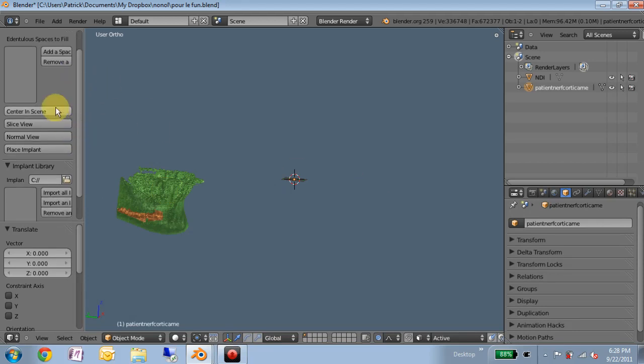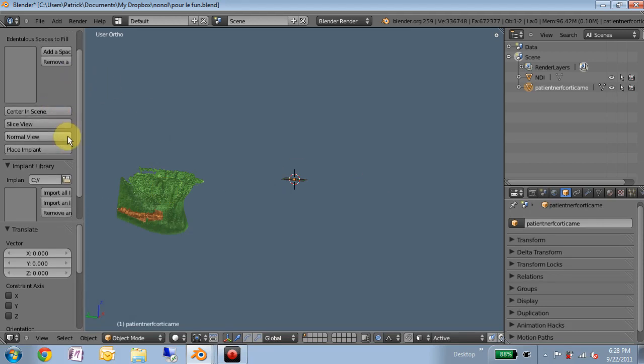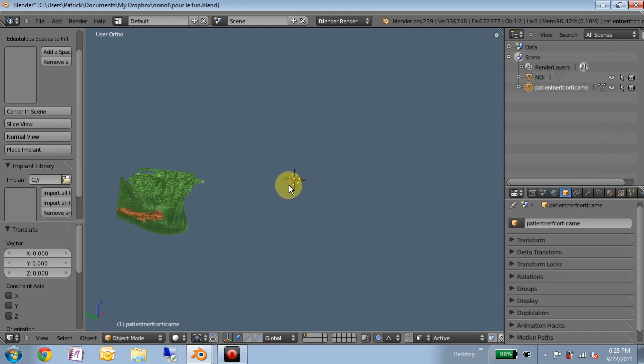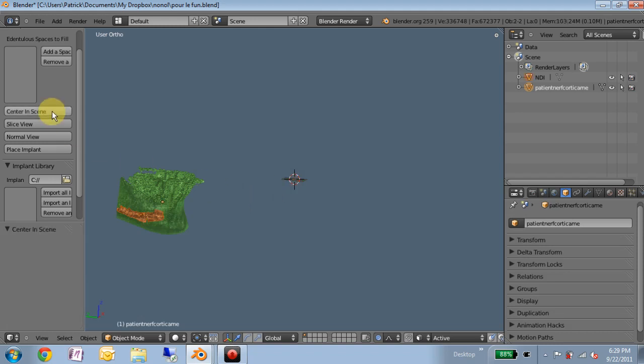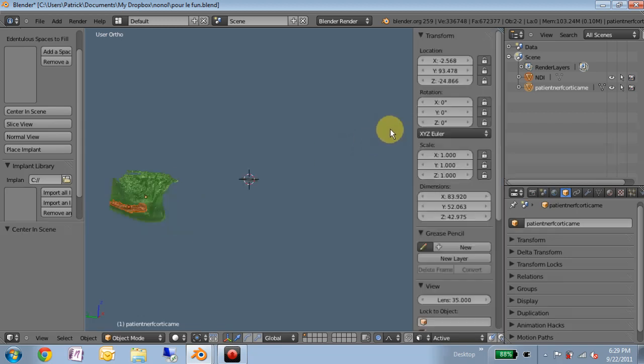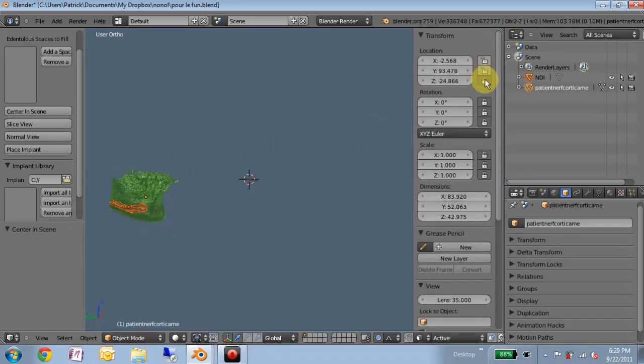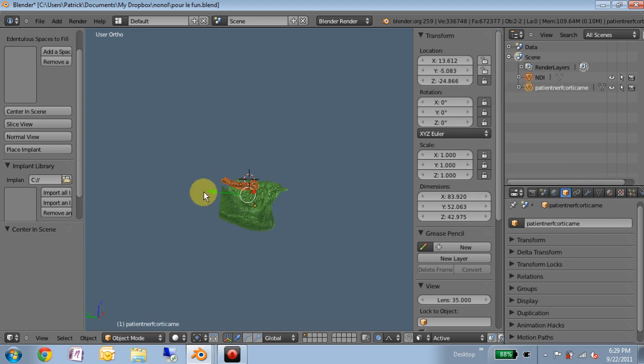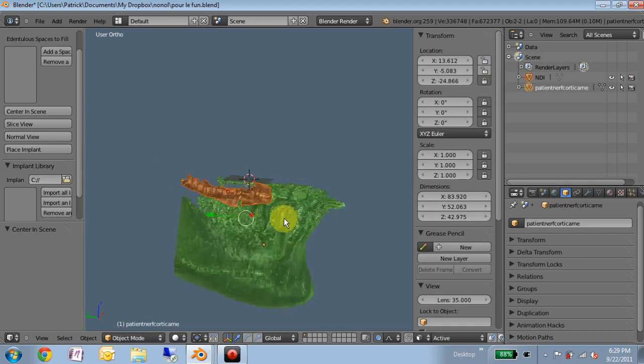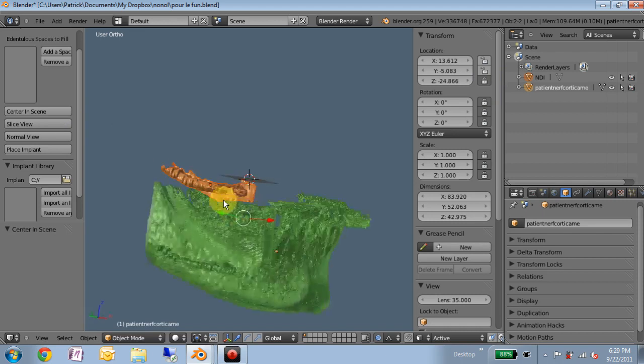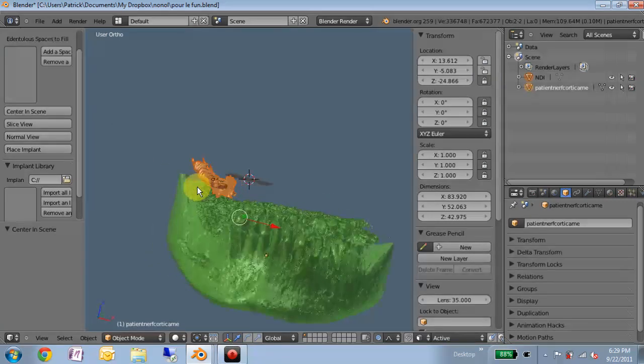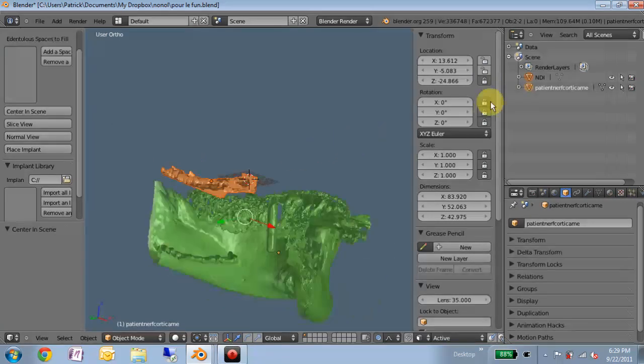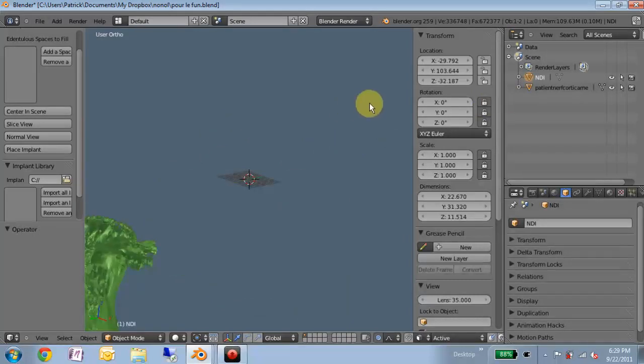So I made this function called center and scene, which will pull everything to the center. If you have different objects parented to each other, it can cause problems. But for now, if we just center and scene, we notice nothing happens. That's because these are locked. Now if we center and scene, everything jumps here.